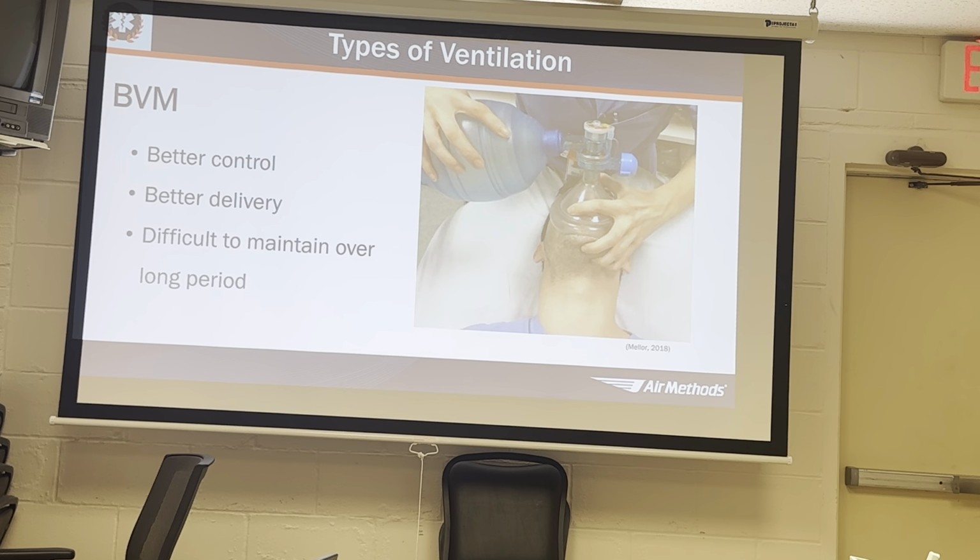Maintaining a good seal between the mask and the patient, and making sure we're not giving excessive tidal volumes. We're squeezing the bag until we get that chest rise, and once we see that chest rise, letting it fall, and spending 2 times as long exhaling as we are inhaling. Do you guys have PEEP valves on your bags here? Making sure that if that PEEP valve's not on there, since sometimes they fall off the bag, putting the PEEP valve on, giving them a PEEP of 5, right? All of ours are set up with PEEP valves.